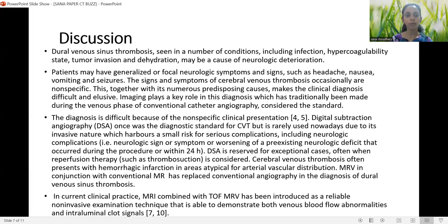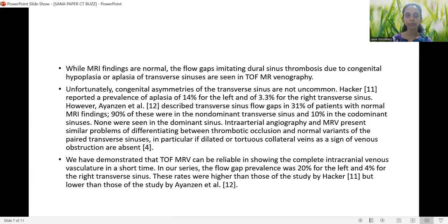Cerebral venous thrombosis often presents with hemorrhagic infarction in areas atypical for arterial vascular distribution. MR venography in conjunction with conventional MRI has replaced conventional angiography in the diagnosis of dural sinus thrombosis. In current clinical practice, MRI combined with time-of-flight MR venography has been introduced as a reliable non-invasive technique able to demonstrate both venous blood flow abnormalities and intraluminal clot signals.